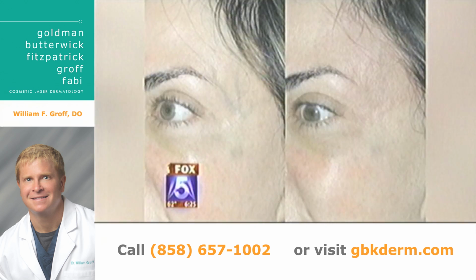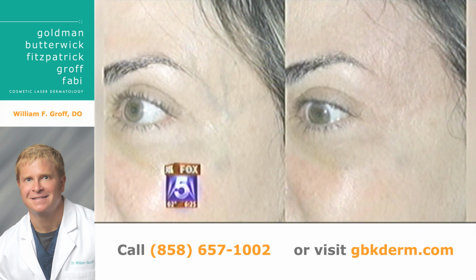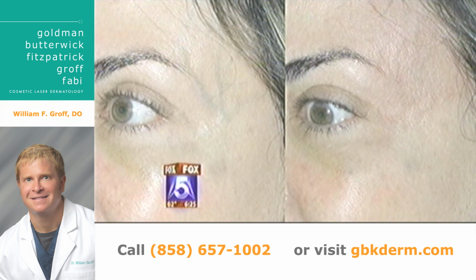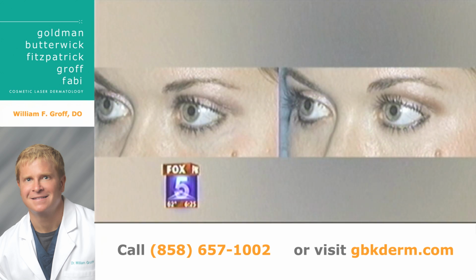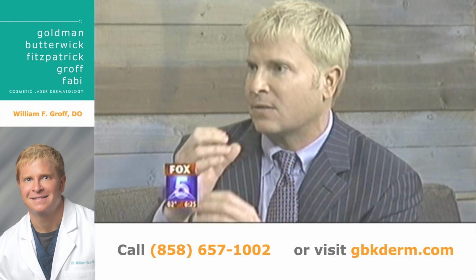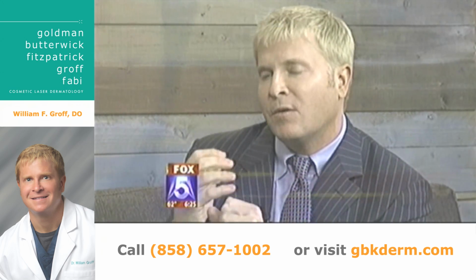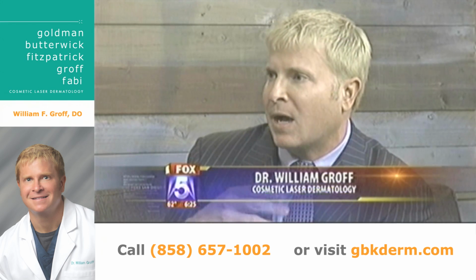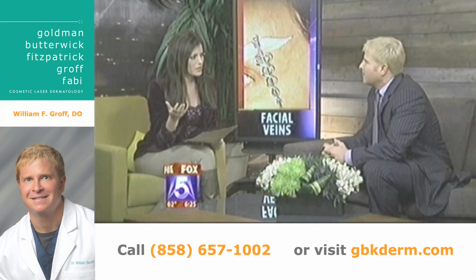So tell me, how does it feel when you apply the laser, and what does it do exactly? That's a good question. What happens is when I fire the laser, the first thing that happens is a cold spray comes out. Now that spray protects the top layers of skin, and then a split second later, the laser fires, passes through the skin without injuring the skin, and goes right into the vessel. Now what that does, it causes the vessel to close down and collapse upon itself. And thereby the vessel shrinks instantly, and then the body over a period of a few weeks absorbs what's left of the vessel.